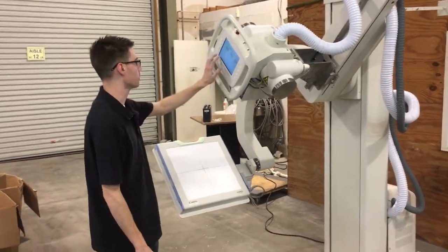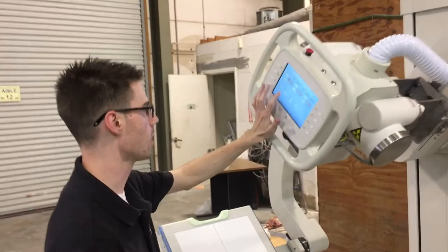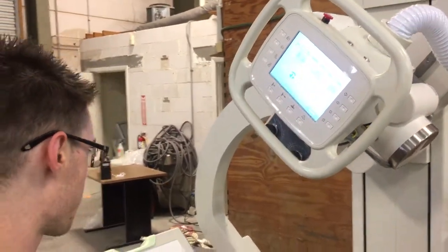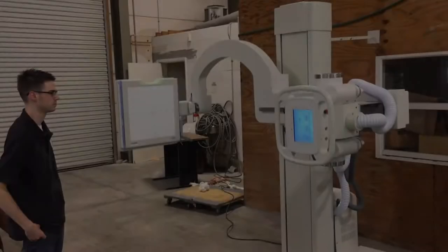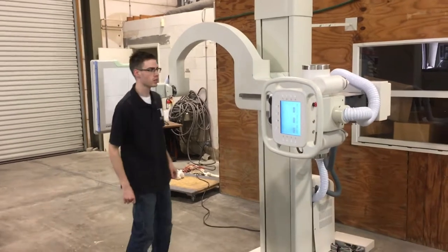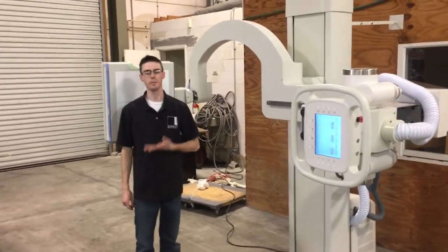Now what we're going to do is put the U-Arm in a horizontal position. From this position you can do chest or any of the upper extremities.